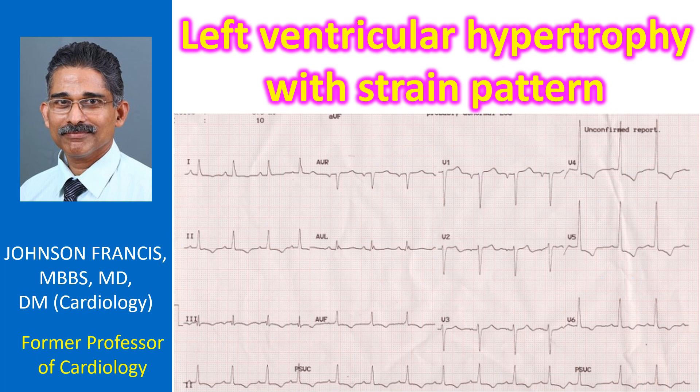Negative P waves in lead V1 are indicative of left atrial overload. Shallow T wave inversions are seen in inferior leads. Two supraventricular ectopics are also seen in the rhythm strip.